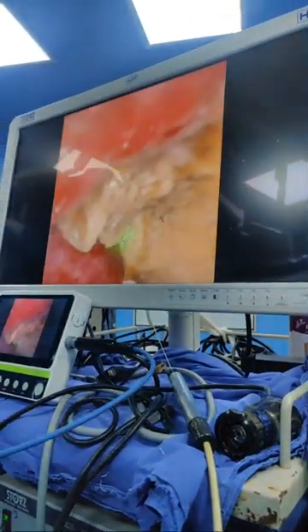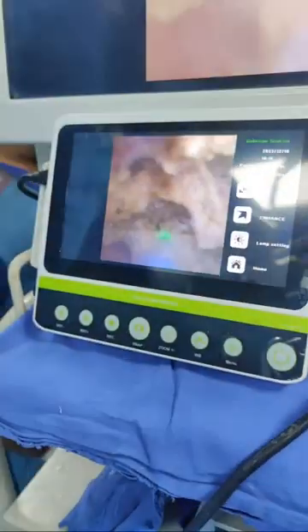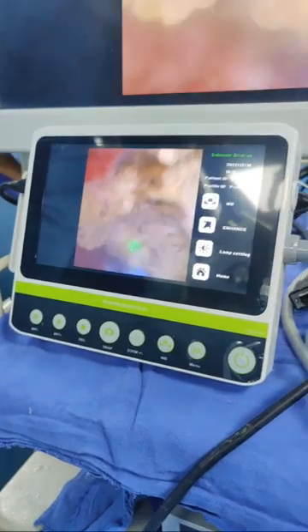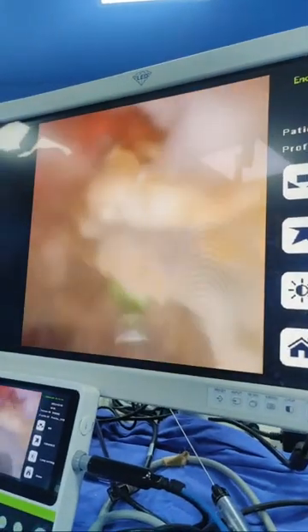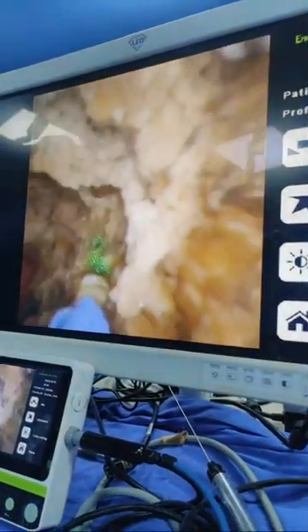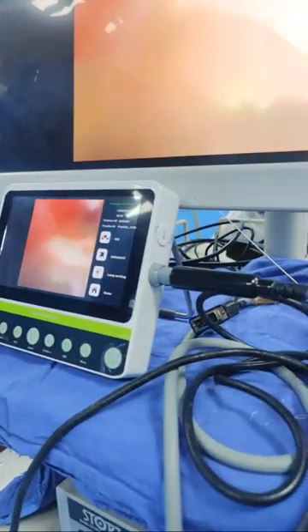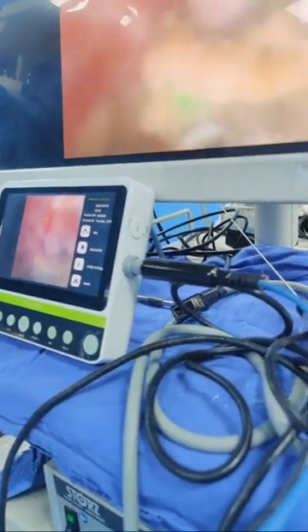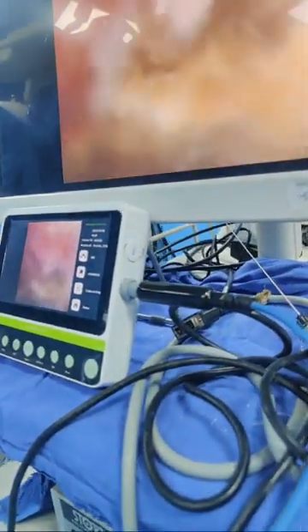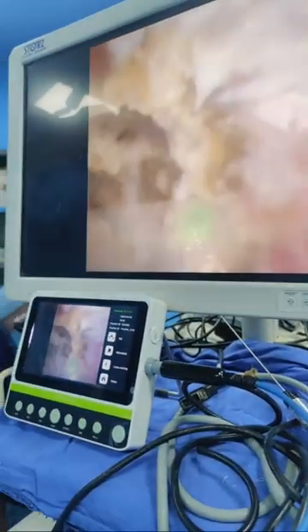So we have a monitor also, and this monitor has been connected with our own monitor. So you can have both the images. You can work with the smaller monitor also, which is supplied with the nephroscope. This has an inbuilt recording system also, as Dr. Kaushik is saying, and we can record the whole procedure.